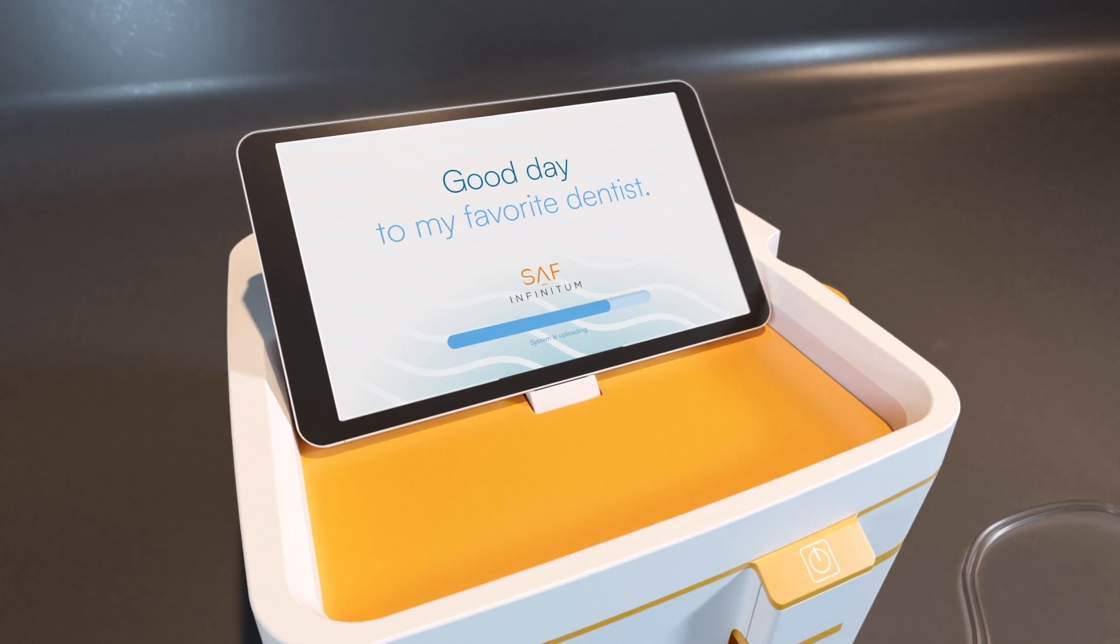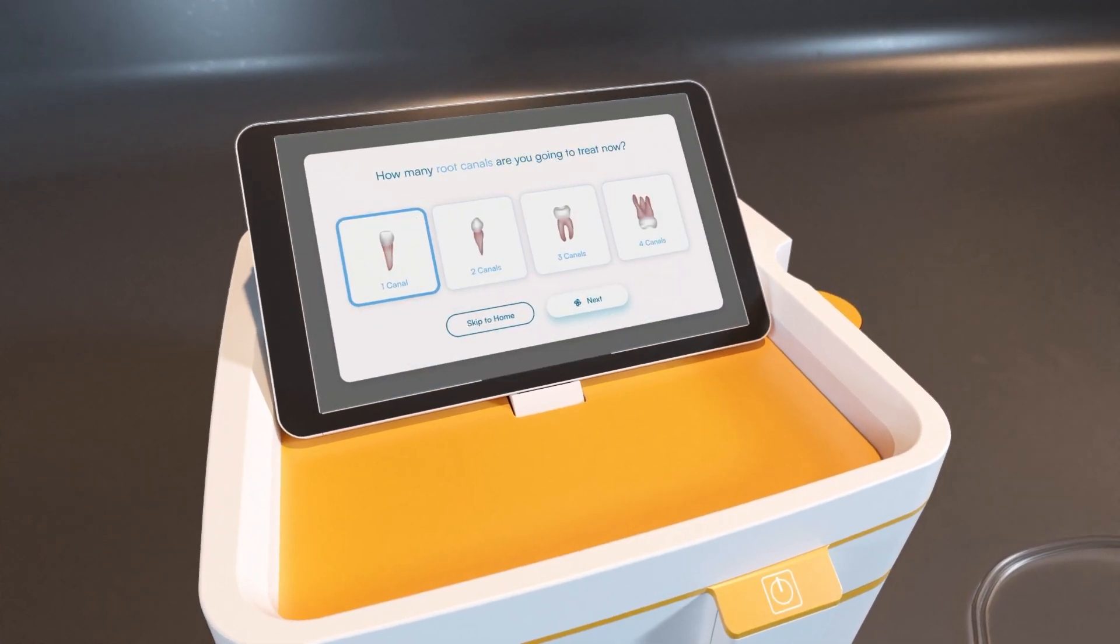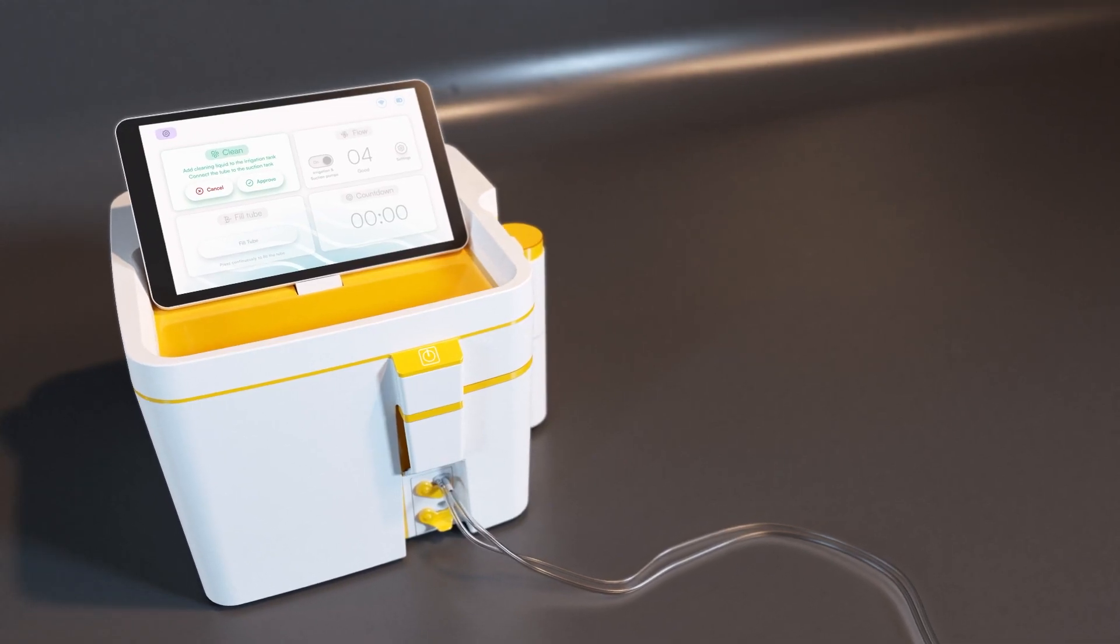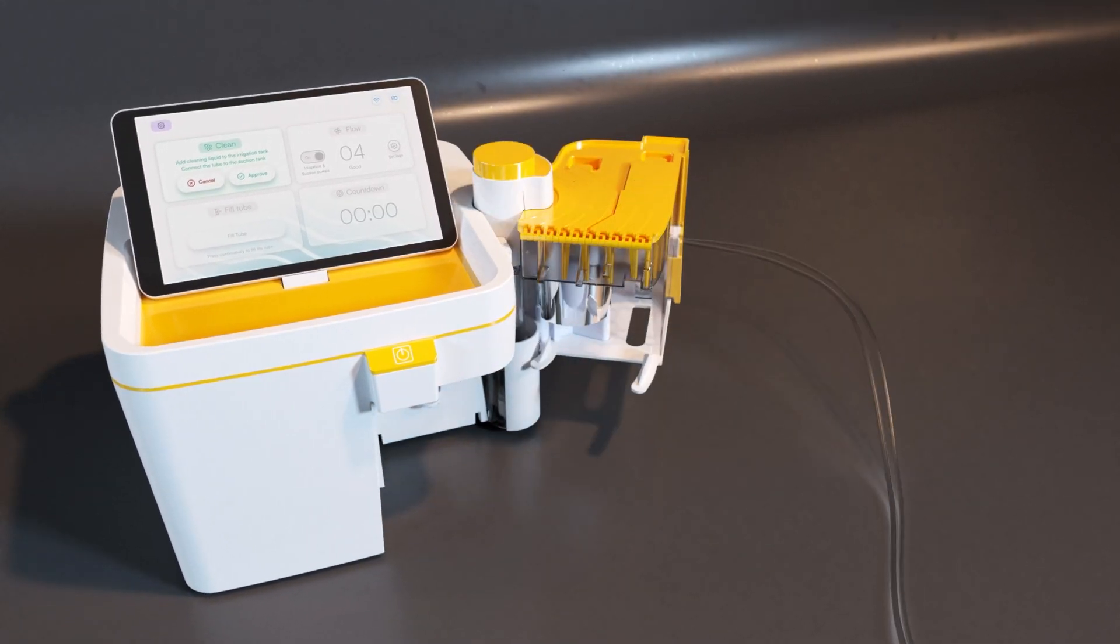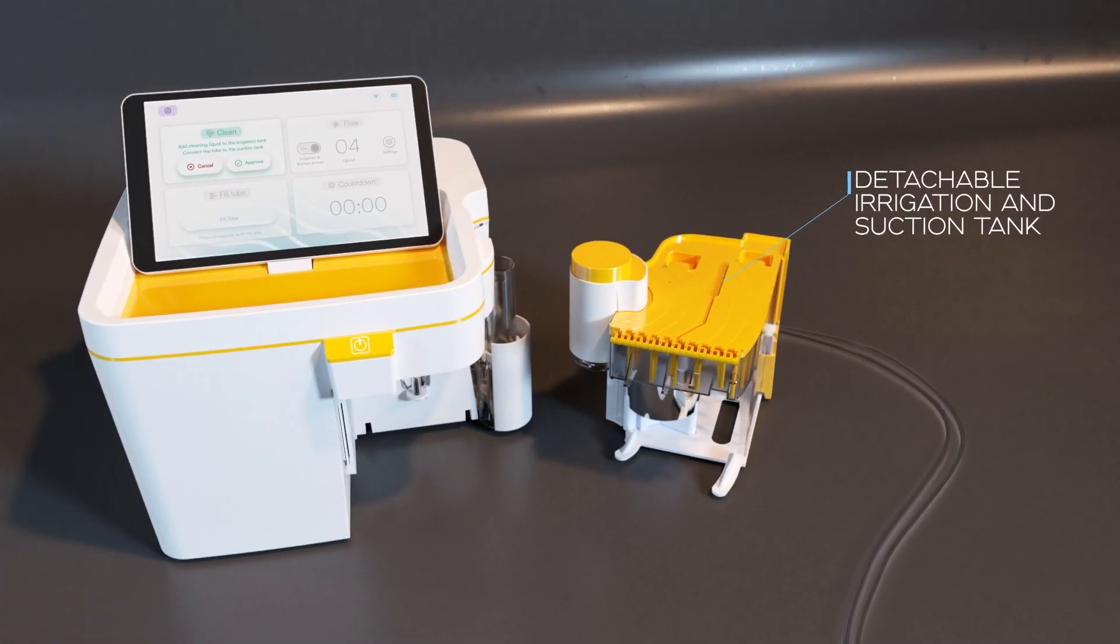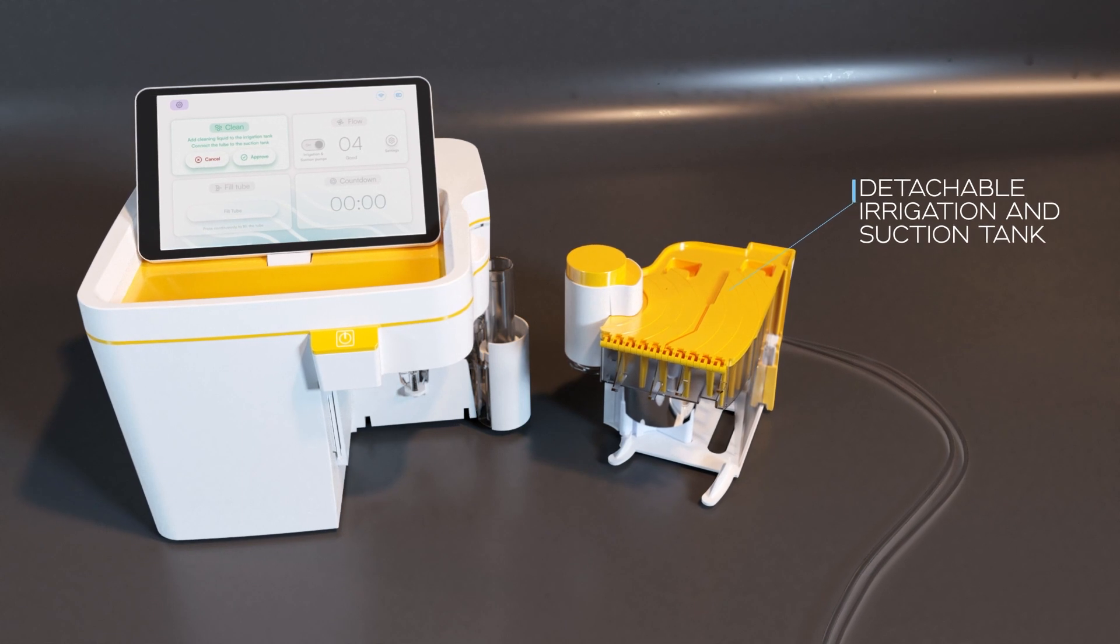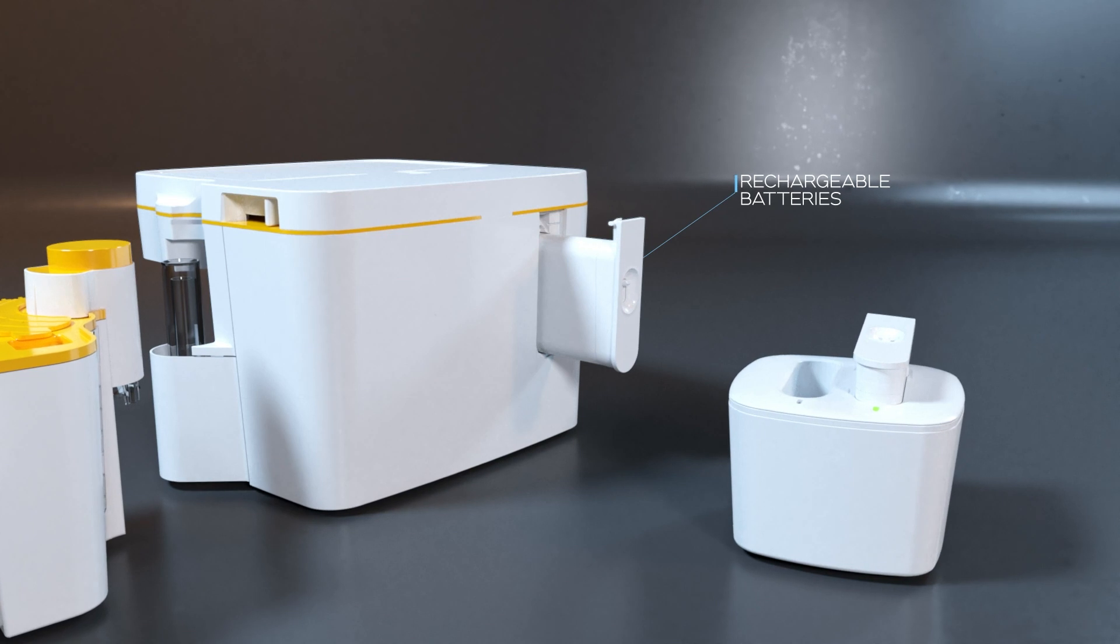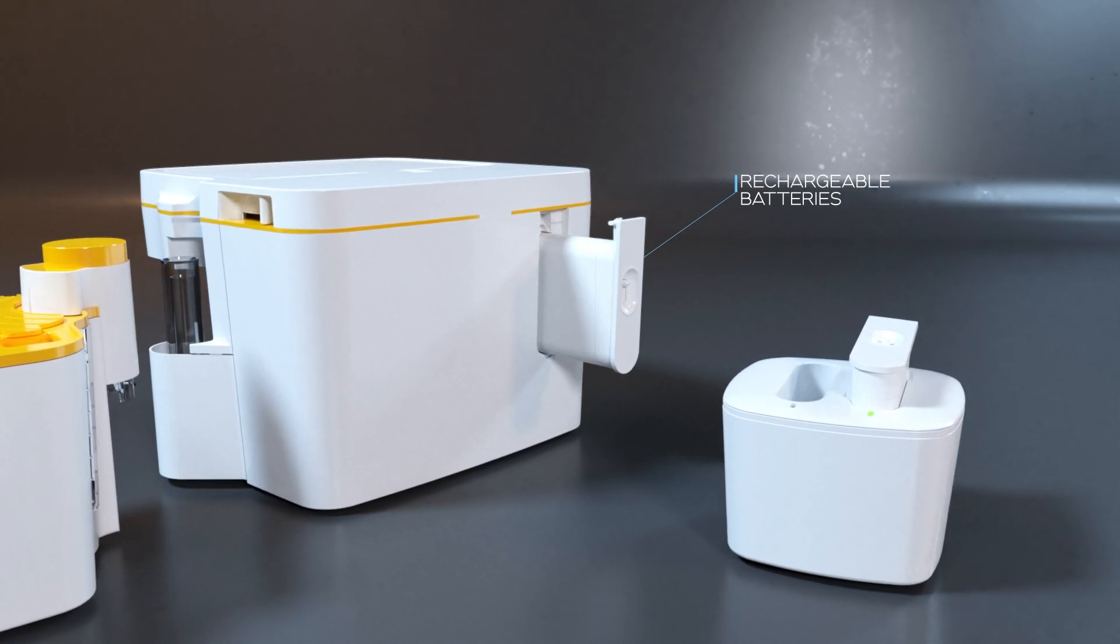An intelligent control center supervises the entire procedure by an intuitive graphic user interface. The main device has a detachable irrigation and suction tank apparatus with peristaltic pumps and is operated by a wireless signal from whichever motor is being used. It operates on rechargeable batteries and includes a self-cleaning mechanism for easy maintenance.